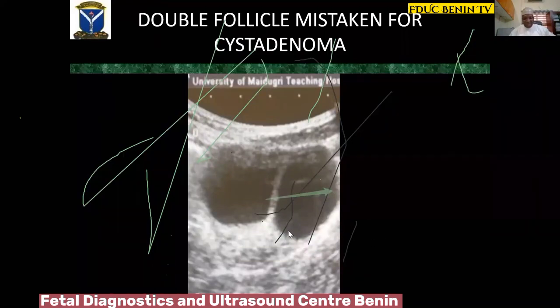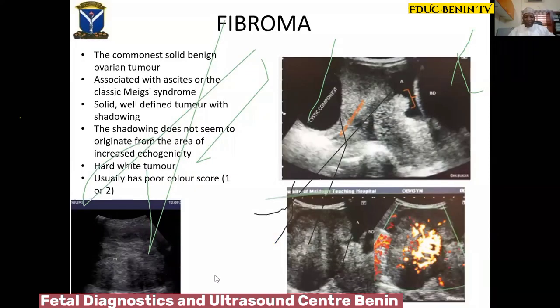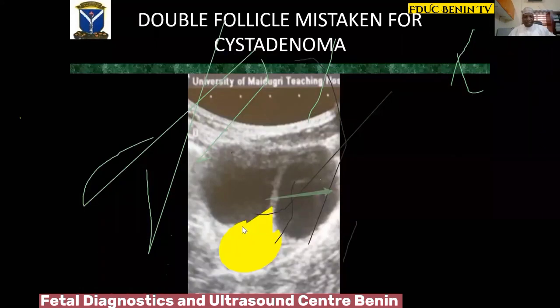When I reviewed a misdiagnosed image, I realized it looked more like a lambda sign — two follicles with an echogenic area at the tip of the arrow. This looks more like twin follicles than a double follicle. When you see this lambda sign, be sure this is not a septate cystadenoma. I mistook this for a cystadenoma; in actual fact it was a double follicle. Just remember the lambda sign.